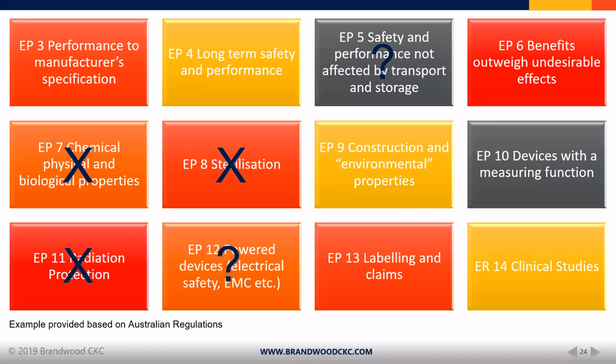and there will be some of those essential principles which may or may not be applicable depending on your device. Very unlikely would you need to demonstrate compliance with sterilization or biocompatibility, as they relate to hardware devices. So it's going to be a case of reporting justifications for why that's not applicable to your products. There are also some of those essential principles which will need to be assessed on a case-by-case basis.